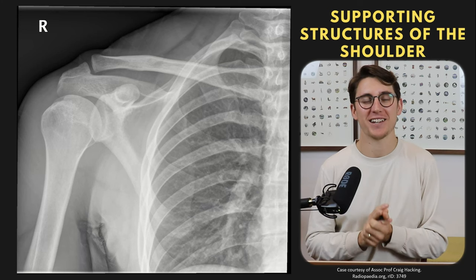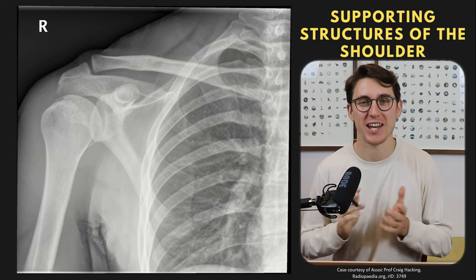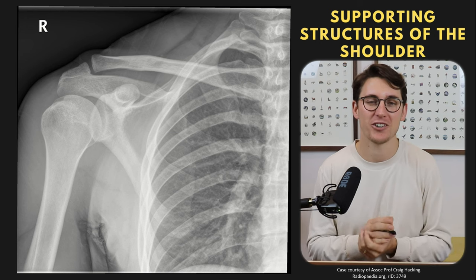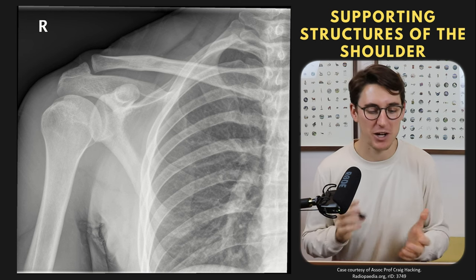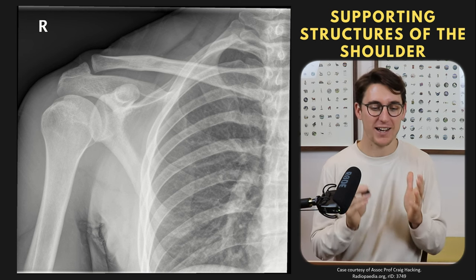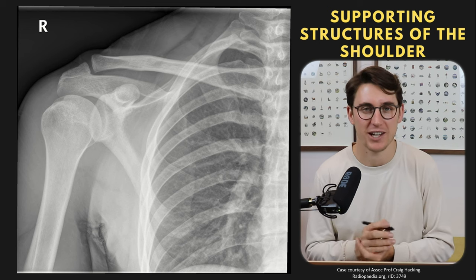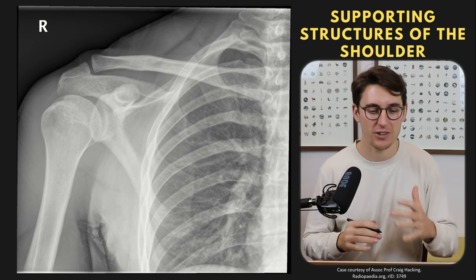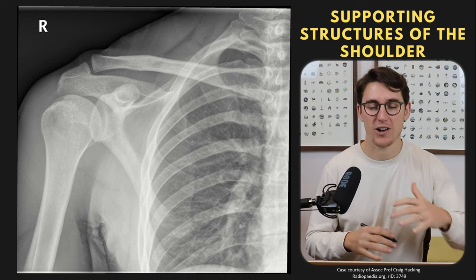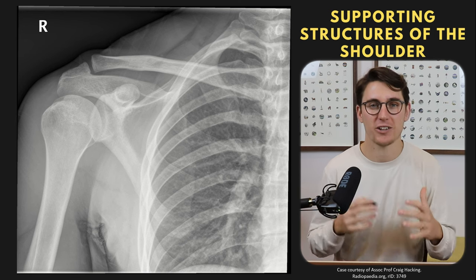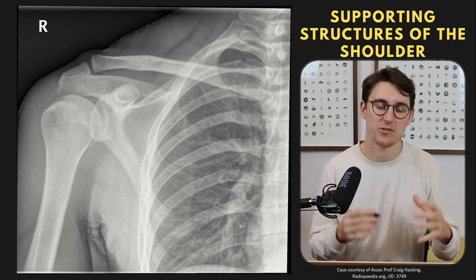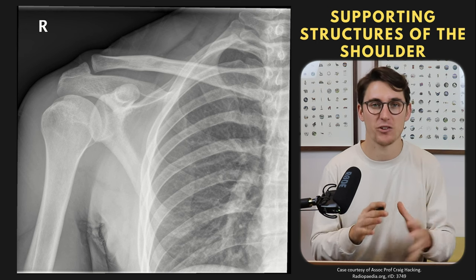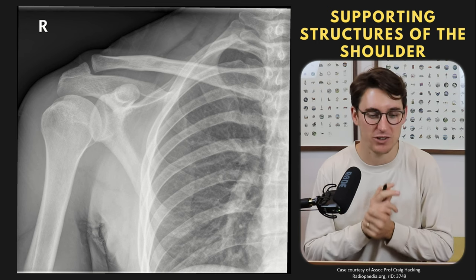Hello everybody and welcome back to another anatomy video. Today we're going to be looking at the anatomy of the shoulder in some detail on an MRI scan. You might be wondering why I have an X-ray up — I want to make sure we're all on the same page. With MRI, a single slice can confuse people because their understanding of the surrounding anatomy is poor, so I want to cover those anatomical structures on an X-ray first.